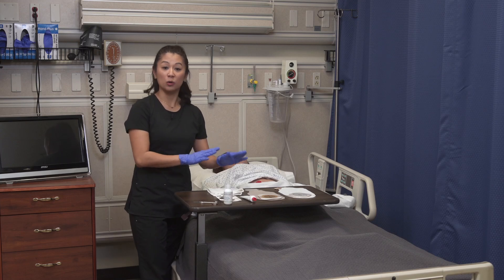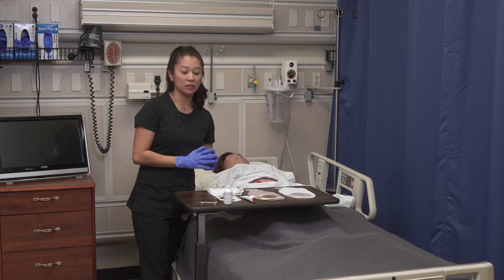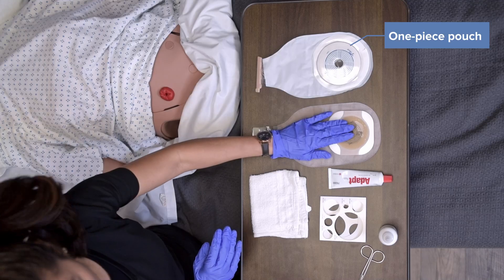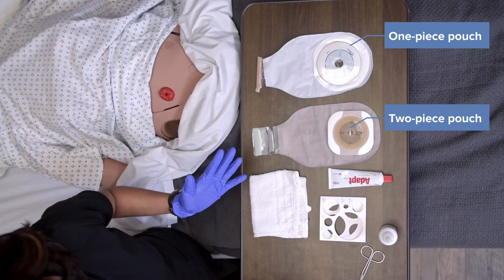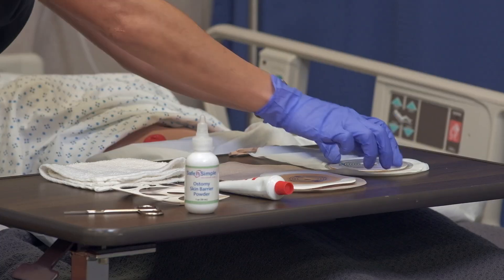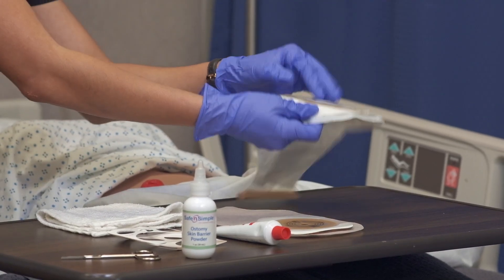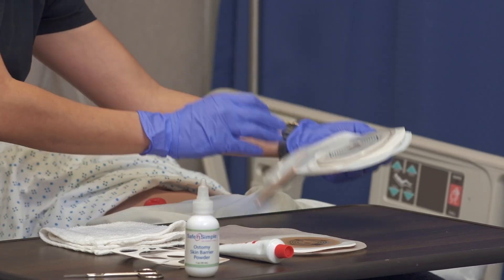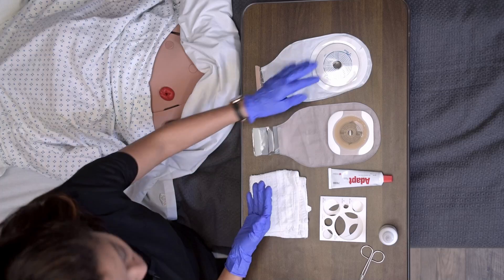Let's take a look at the equipment itself. I've got a couple of different systems here: a one-piece pouch and a two-piece pouch. The difference is exactly that — one piece versus two. With the one-piece, notice the back half is all together as one system. Also notice the clamps — this is a regular clamp that you may see on many different pouches.